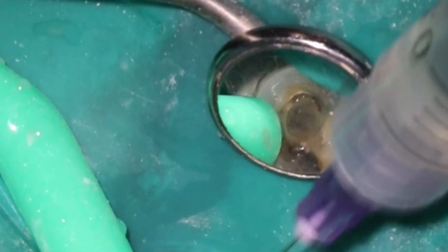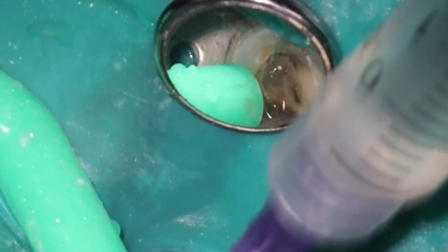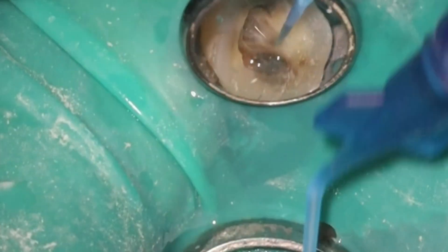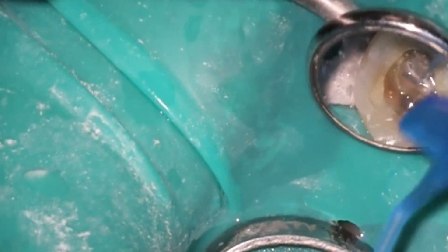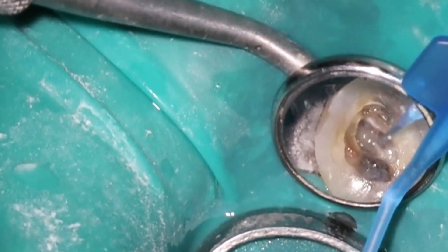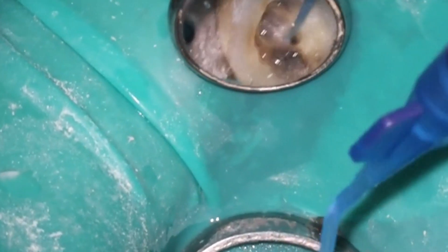We're using Triton here. I had thought about potentially doing the GentleWave, but the drainage really wasn't that bad so I didn't think it was going to add a ton. You could — if you really love the GentleWave, go for it; if you don't, don't. I think it doesn't really add too much to this case.